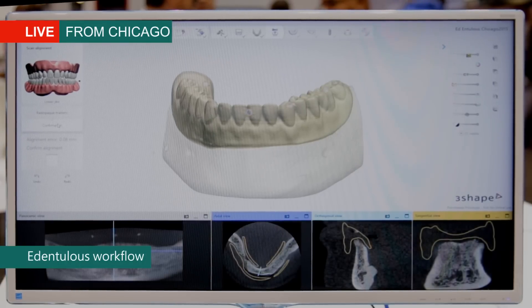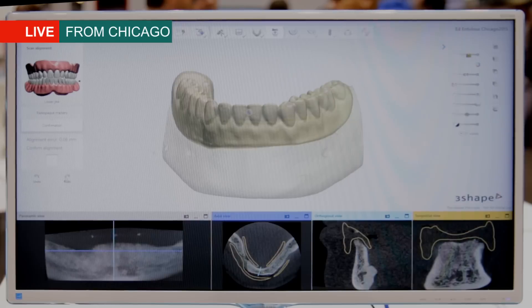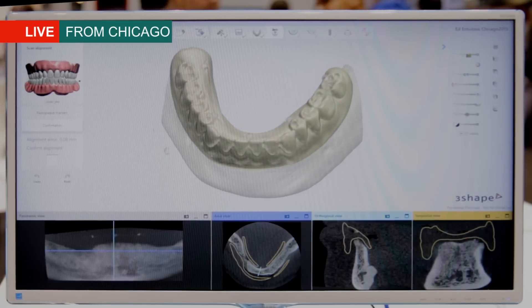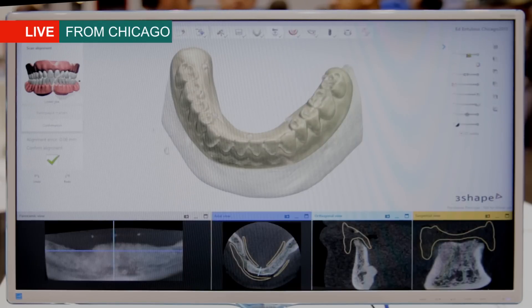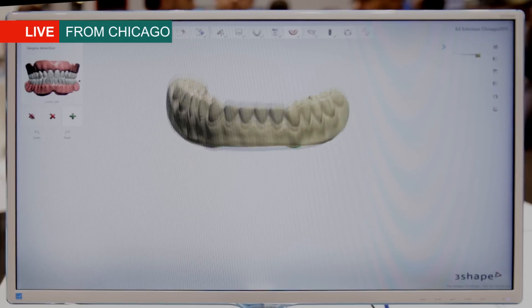Once we've detected the markers, we want to align the scans as we do in the normal workflow as well. Here we see the result of the alignment, and when the alignment is done we confirm it and move on to the next step.